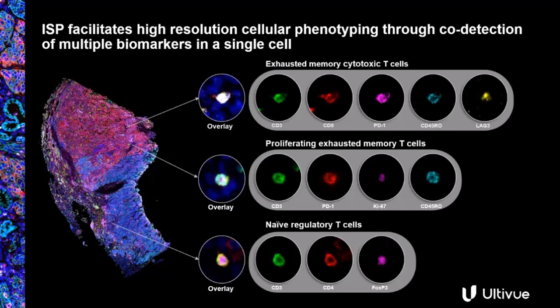So once we have all these markers and channels overlaid, we can look at the cells and really how the assay stains them. And in this case, just an example, we see that even in the same cell type, we can have a multitude of different expressions that then are overlaid. So we can combine them then all into a deeper phenotype. And that shows why it's so important to have an excellent co-registration on this single cell level to really be able to combine these. If there's a small shift, you would then have a false colocalization of staining.